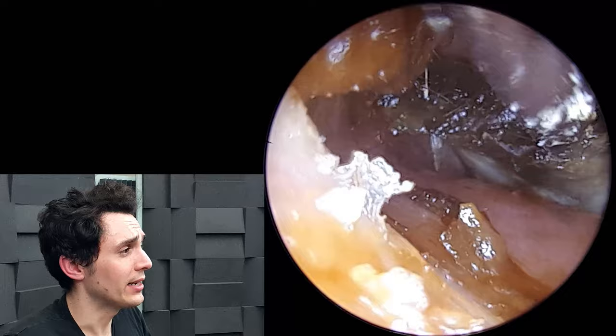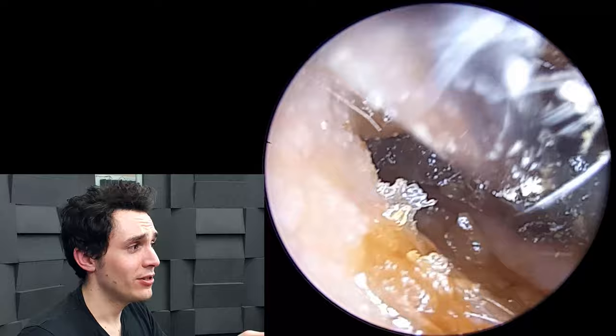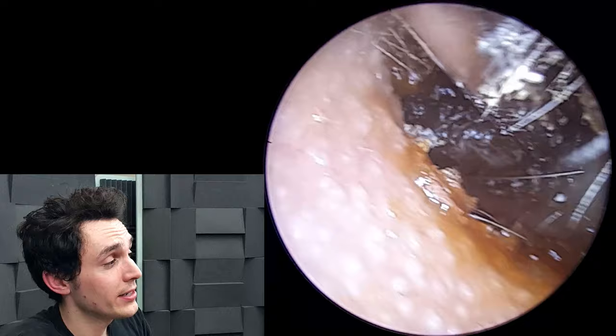You wouldn't think that such a large amount of wax can be hidden in that recess, so it's understandable why the patient couldn't hear very well. After the first consultation they felt there was a little bit of improvement but not much — you can see why, seeing as this was shoved right up against the eardrum.